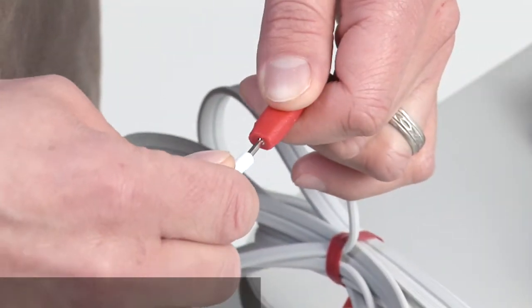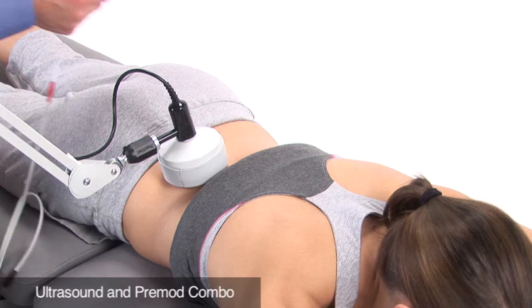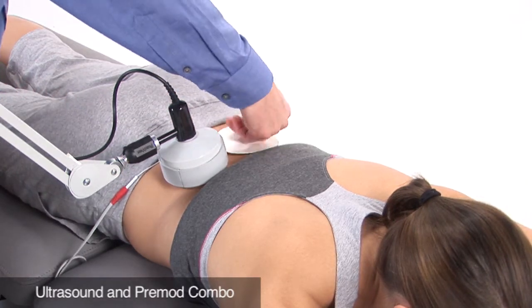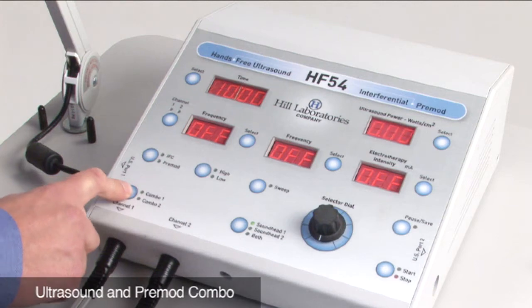The HF54 has the ability to perform ultrasound in combination with pre-modulated current. The sound head will produce ultrasound and pre-mod current. An electrode with a surface area equal to or larger than the sound head will act as the second pad. Plug the large electrode into the red lead wire from channel one and position the electrode adjacent to the sound head. Select sound head and combo one, then press the start button.